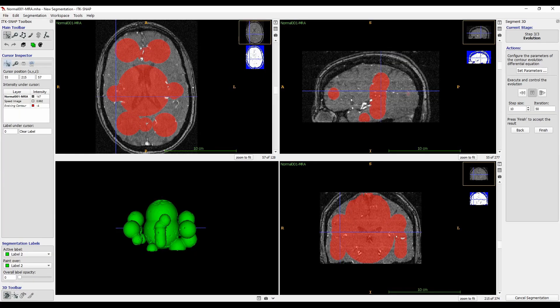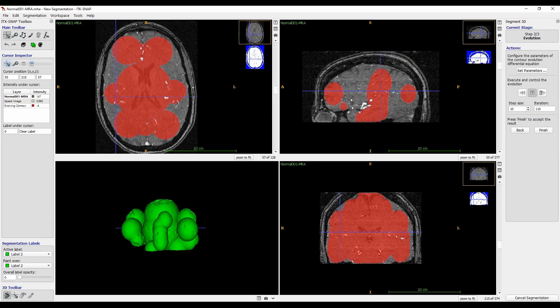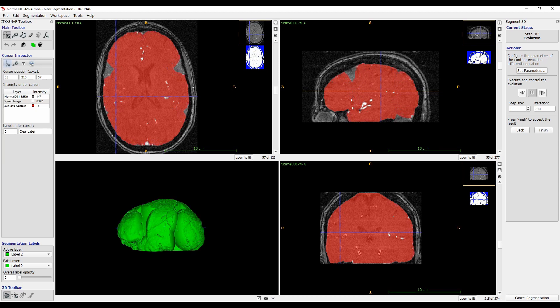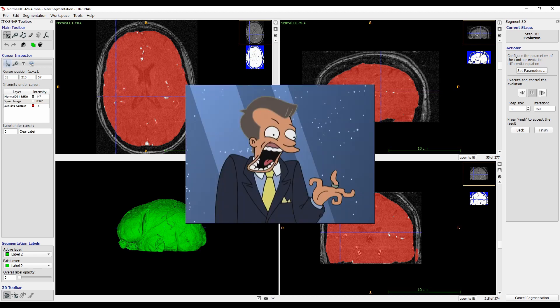Most of the software I mentioned also have automated functions that can help you color each part, so that you don't have to manually fill in each scan one at a time and ruin your wrists.